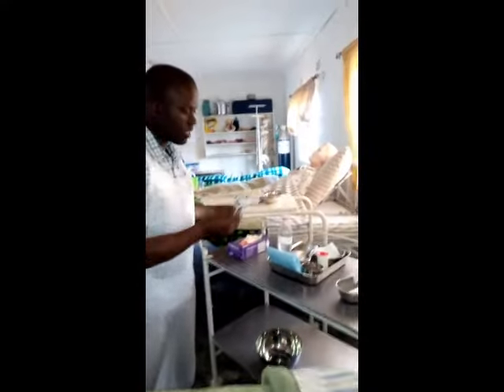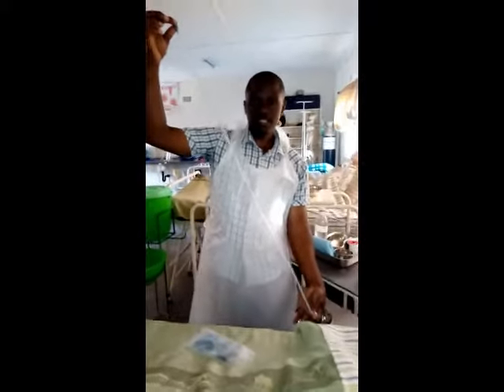If you look at the tubes, there are different types of tubes. As of today in this presentation, I'm going to show you a pediatric tube and an adult tube. Here with me are the samples. So this is an adult tube. It's as long as this much, as you can see.